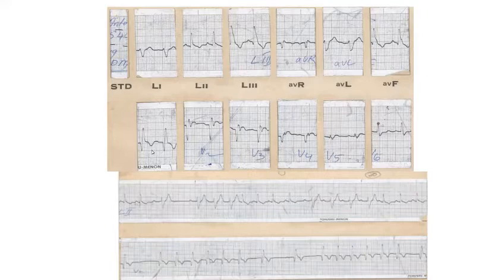See, he already has got a right bundle branch block. Yes, sir. See, one clue. When you look at the rhythm strip, is there a change in the pattern of the QRS complex? Yes, sir, in the first strip the QRS complexes are changing, but later on they are not changing. Is there a change? I don't think there's any change in the pattern of the QRS complex, but it is the conduction. There are some AV block and all. But if you look at the above strip, sir? Above strip is what I'm asking. In V1, is there a change in the pattern?